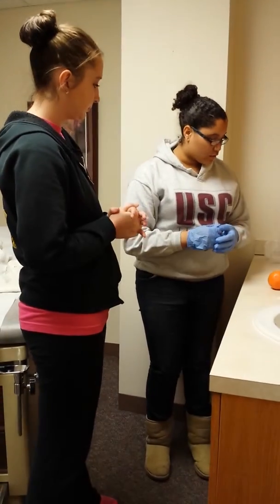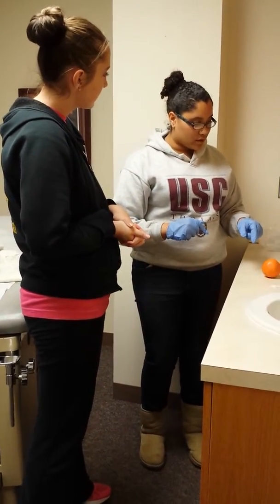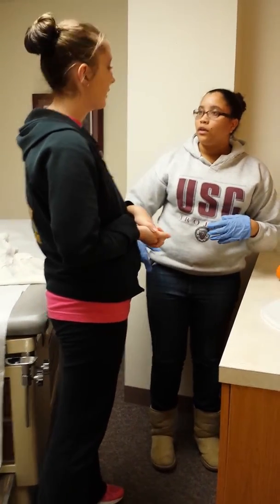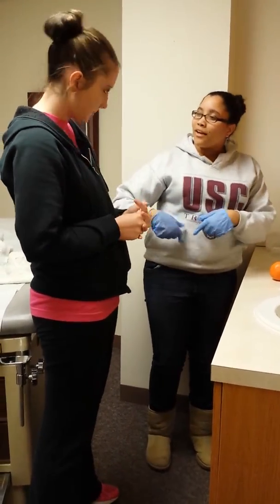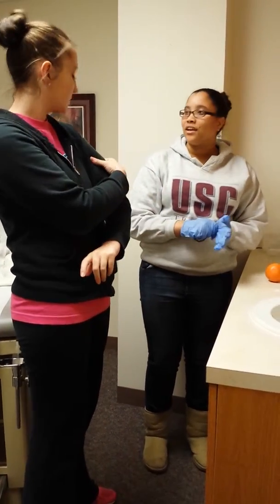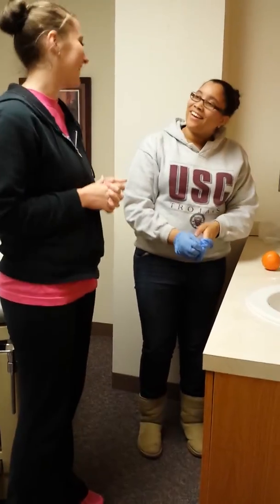Do you have any questions? No, but just to make sure — I would put it somewhere that's like a fatty area, like on my thigh, my stomach, and the back of my arm. And then you just squeeze the skin up just a little bit when you do it. I think I can do this. Thank you.